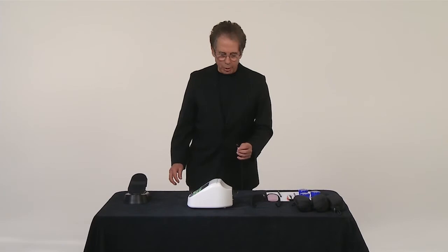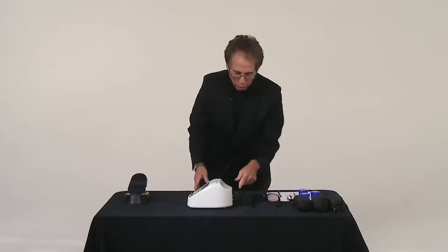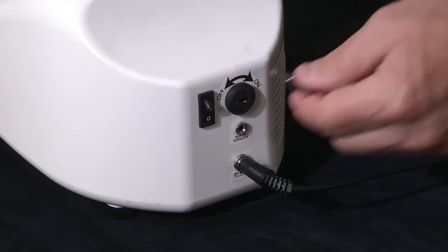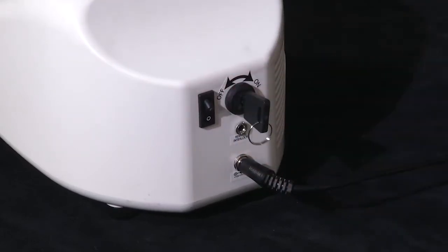Now we're going to assemble the Sterling laser. First we will connect our power cord. Before I turn the key on I'm going to put my safety glasses on — very important, you never know where energy is going to go. We put the key into the system, we turn it on, and now the laser will be ready to work once we press this button.